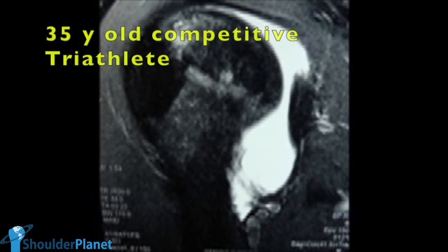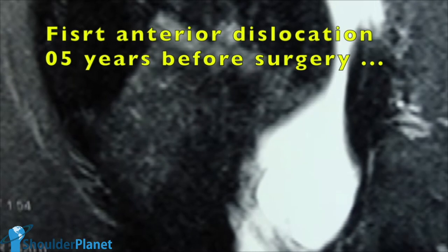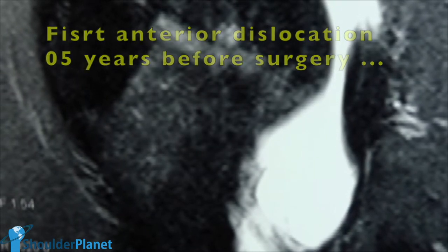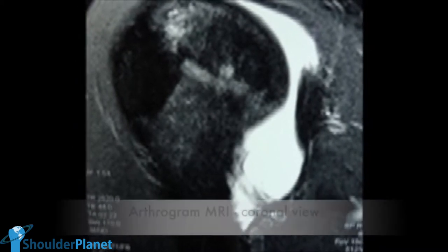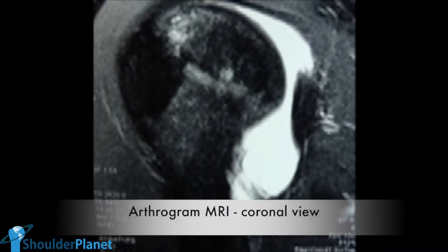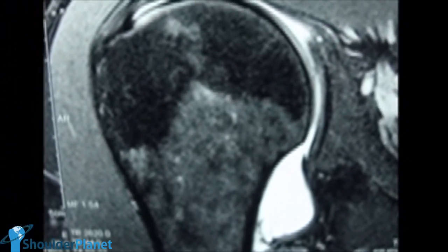This case is about a 35-year-old patient who is a triathlete and who had his first anterior shoulder dislocation about five years ago. After that, he stood for four years with no problems in his right shoulder, swimming okay, but he had his second anterior shoulder dislocation about one year ago. After that, he had something like 20 new episodes and he came to my office in August 2011. This is his arthrogram MRI — we're seeing a coronal view in T2 in which we can clearly see a HAGL lesion in the humeral neck-head region, and this is another image, still a T2 coronal view, revealing the HAGL lesion.